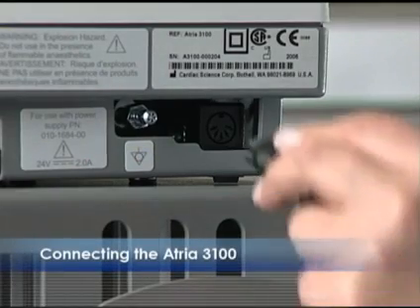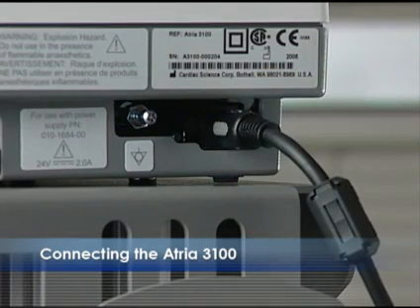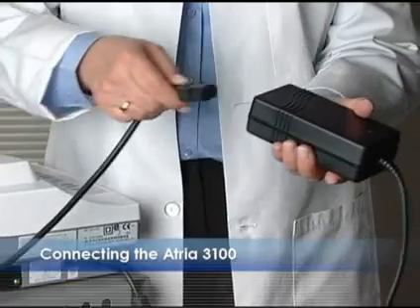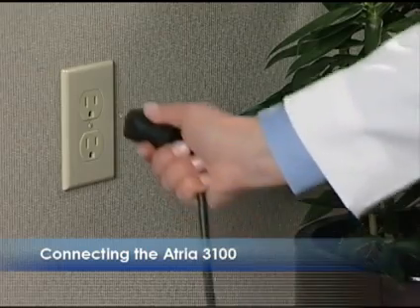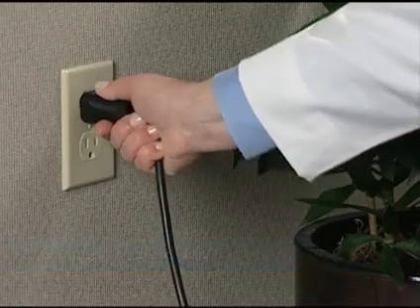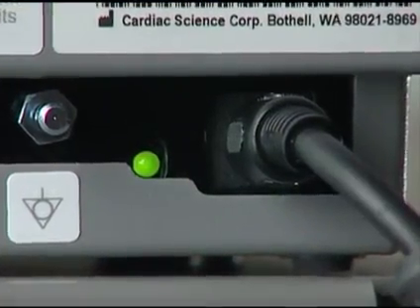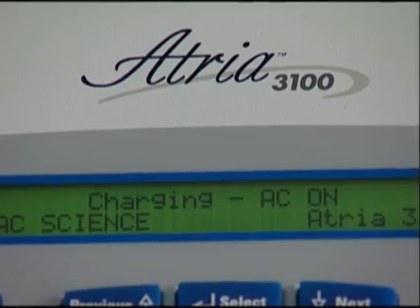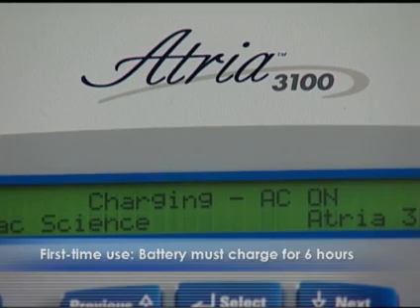To connect to a power source, insert the cable from the power brick into the back of the device near the serial number. Plug the AC power cable into the brick, then into an outlet. You should see a green light on the brick and the device. The battery will automatically charge itself. Before using the Atria 3100 for the first time, you'll need to charge the battery for 6 hours.